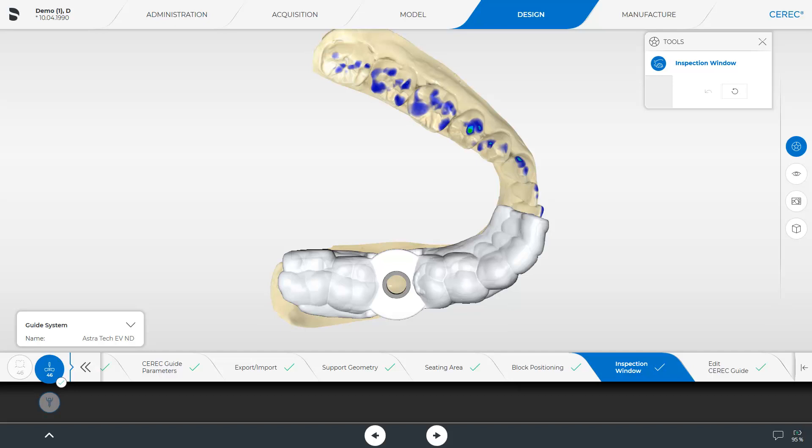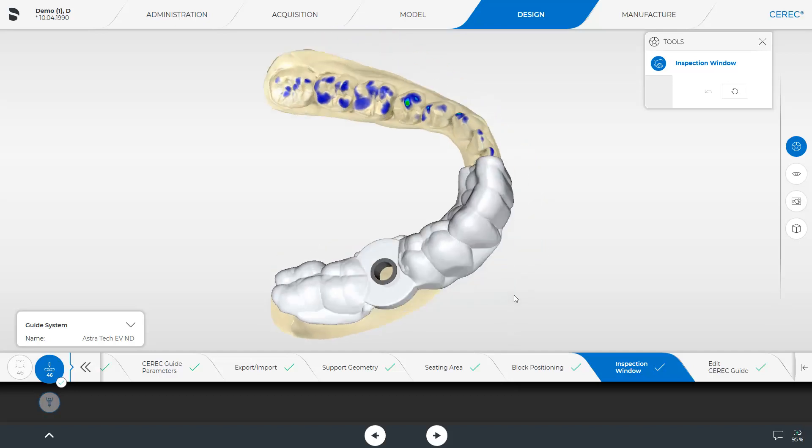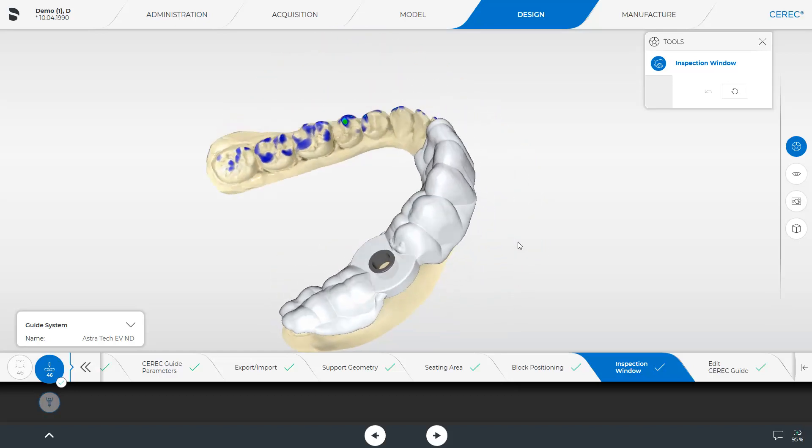Since this is an optional step, it is already marked with a green check mark. The tool Inspection Window is enabled, and as soon as you move the cursor towards the guide, a suggestion is automatically displayed in the areas in which a window can be positioned. The window is fixed in position by clicking the left mouse button.